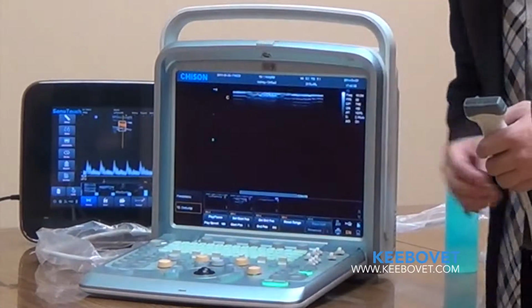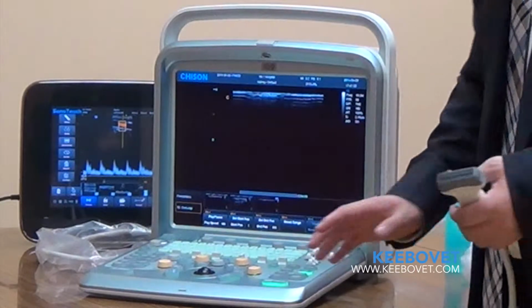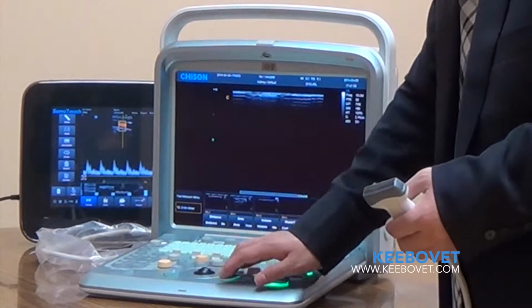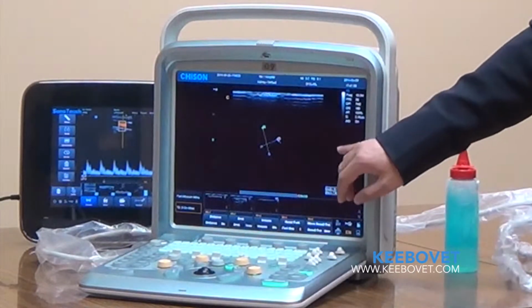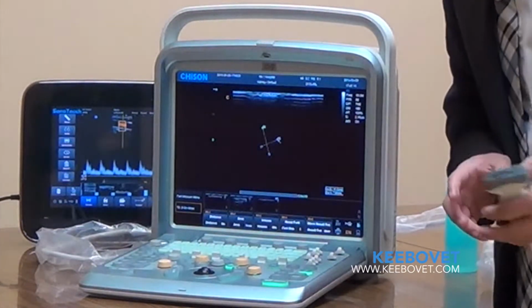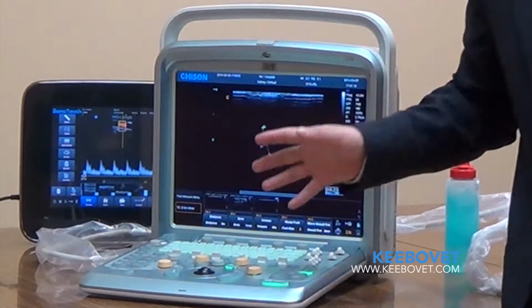Okay, now let's see what's more. Now when we freeze it, sometimes the doctors want to do some measurement. Just for example, I want to measure a distance. And here is the result. Now maybe you think it's very small, you can't see it because you stand far away.